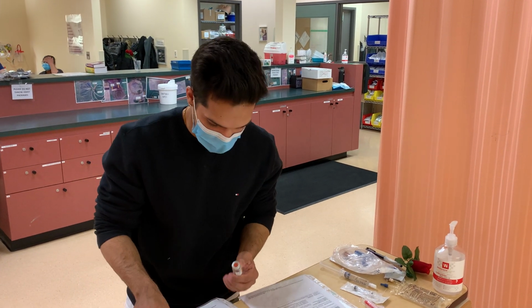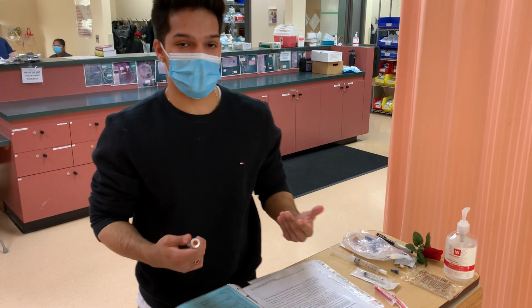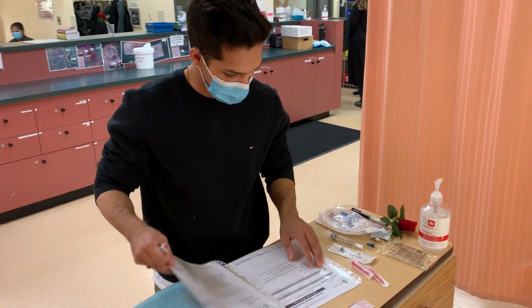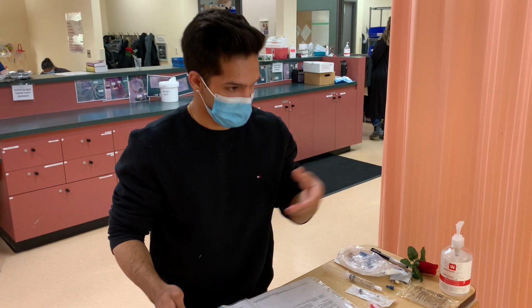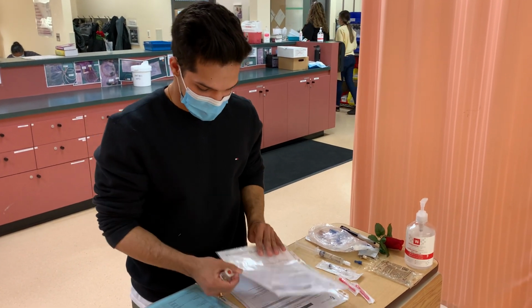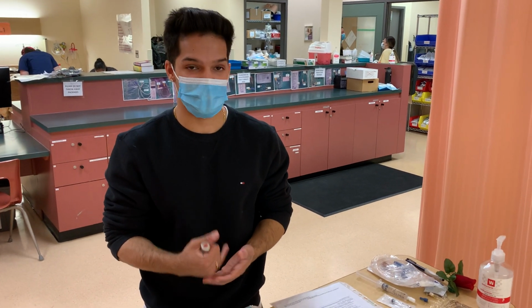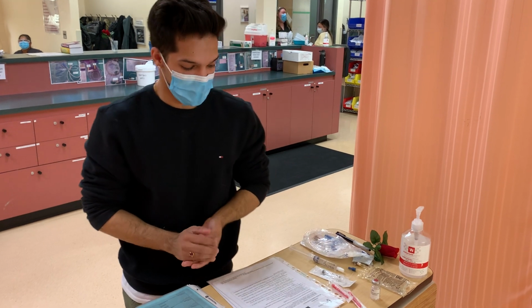Okay, so then after that that was the dose, and then so the right route for this medication is IV. This is insulin continuous IV infusion, and I'm also looking under the section for insulin continuous IV infusion, and this is also IV vial, and then I'm also going to be putting it through the Baxter pump. The time frequency of the medication: this medication is due to be given today and now, and nobody has signed off for it, so we'll be giving it.